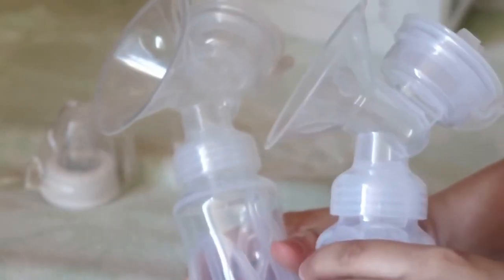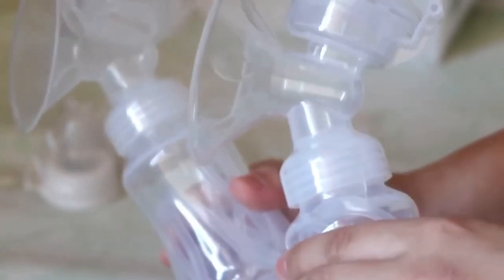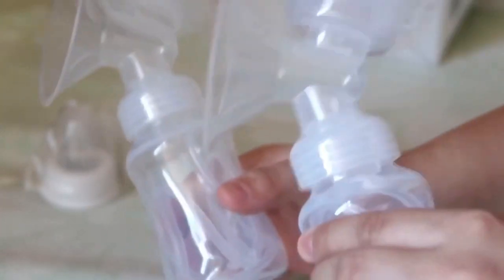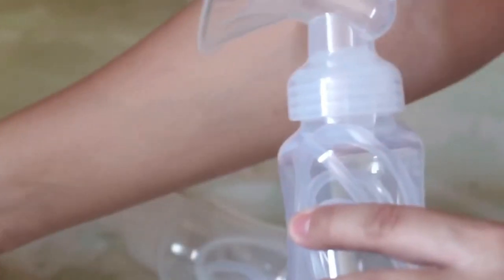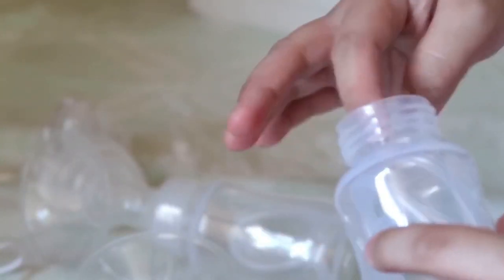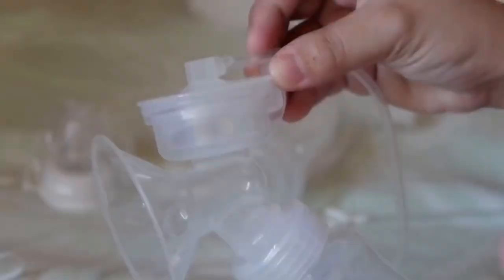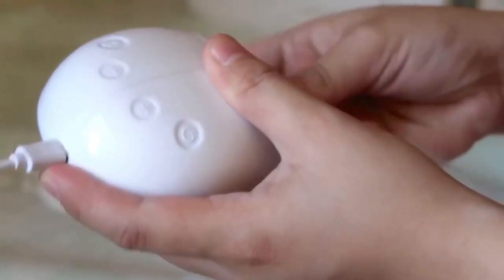So, yun mga feeding bottles natin. It's already connected to the breast shield, diaphragm, and valve. So, no need to connect it. So, ready na siya. Inside of it, may makikita kayong tubes. Ito yung gagamitin para i-connect natin siya sa ating pump motor. So, i-connect natin ang tube dito sa taas. Other end sa ating motor pump. Yun, connected na siya.